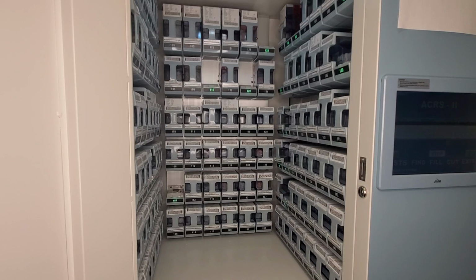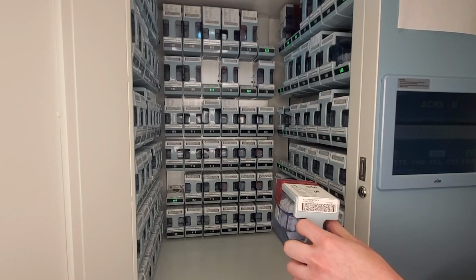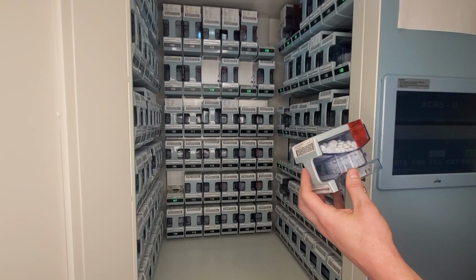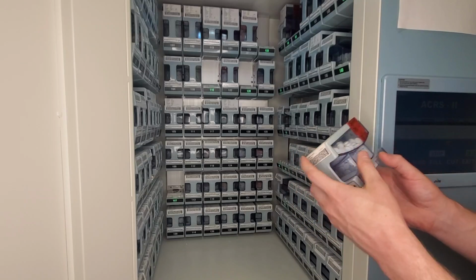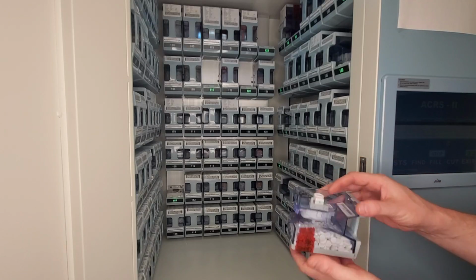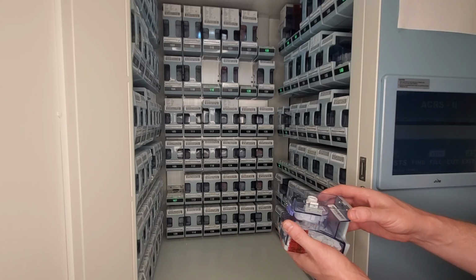So I need to look in here for number 178. I locate the canister. I need to make sure that there are, in fact, tablets or capsules in the canister. If there is, I need to turn the canister over, holding the lid flat in my hand so that the pills do not go everywhere.